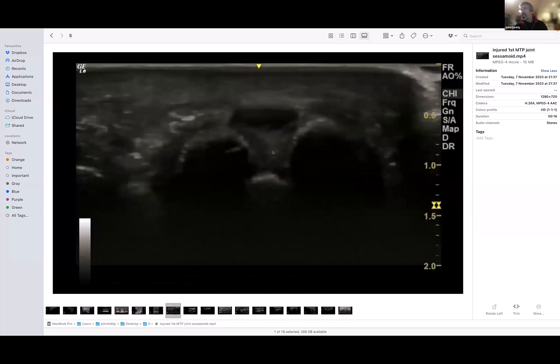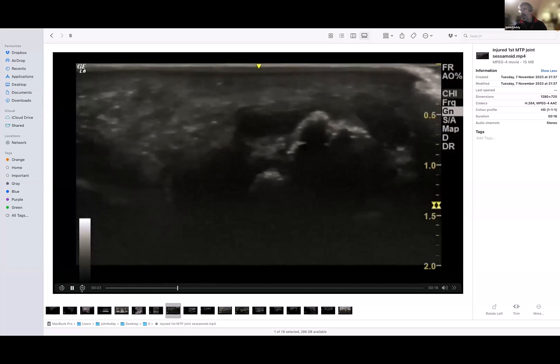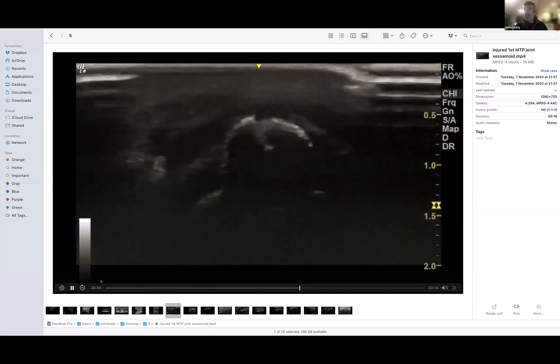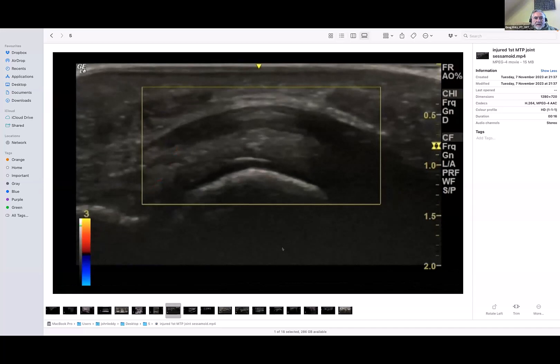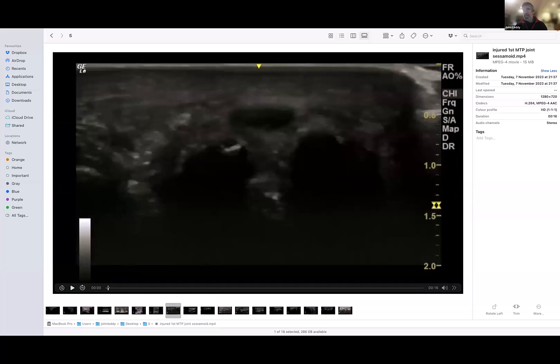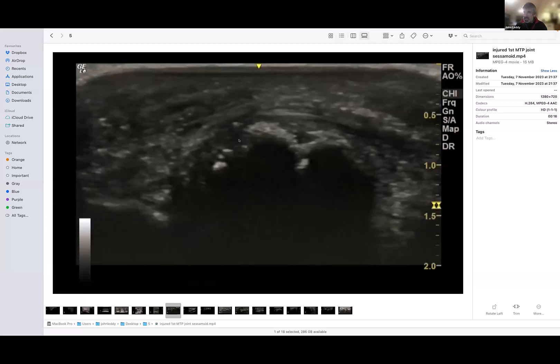Great toe — sesamoid. Abnormal sesamoids are really common; I have one, and they often look like this. It's not something you can reliably call on ultrasound because so many have a fractured appearance anyway. This one had been struck and often they have a bifid appearance — so up to a point it could be normal, but this is not.